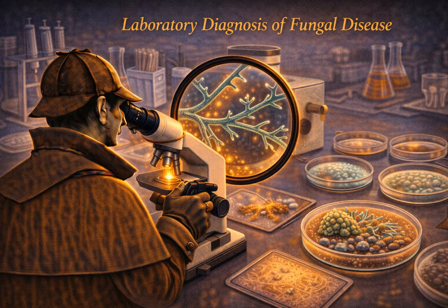Step 3, the culture. The slow-growing truth. Watch out for the cycloheximide trap with Cryptococcus. Use the olive oil trick for Malassezia. And step 4, the biomarkers. Galactomannan, CrAg, and BDG. Use them to see the invisible systemic invaders, but know their structural blind spots. In a world of increasing immunosuppression, the fungi are rising, and the clinical laboratory is the only way to accurately distinguish a harmless background colonization from a lethal invasive infection.